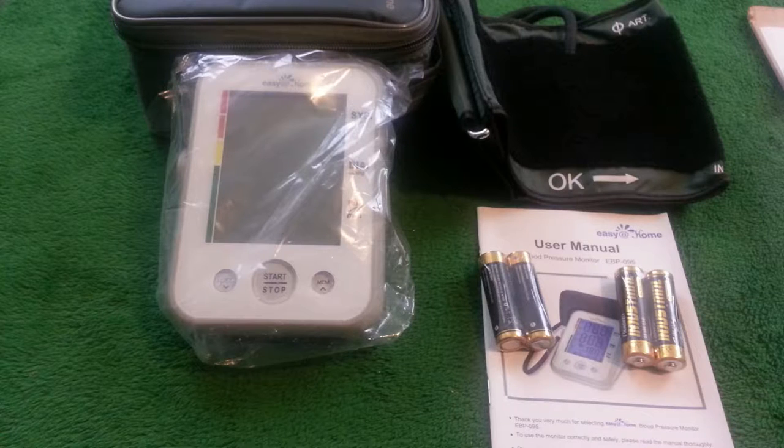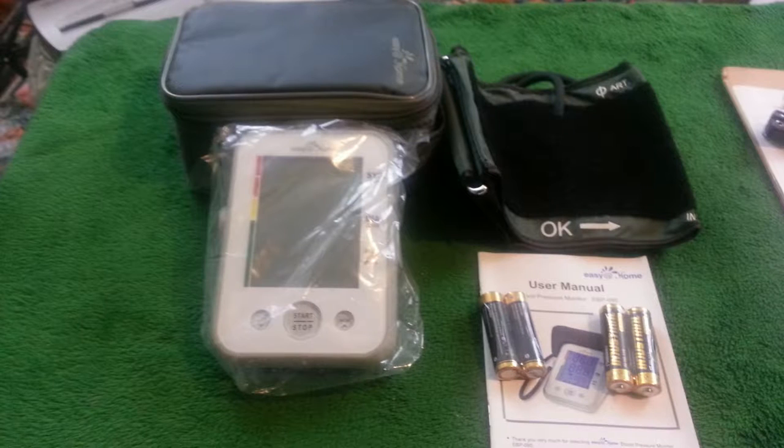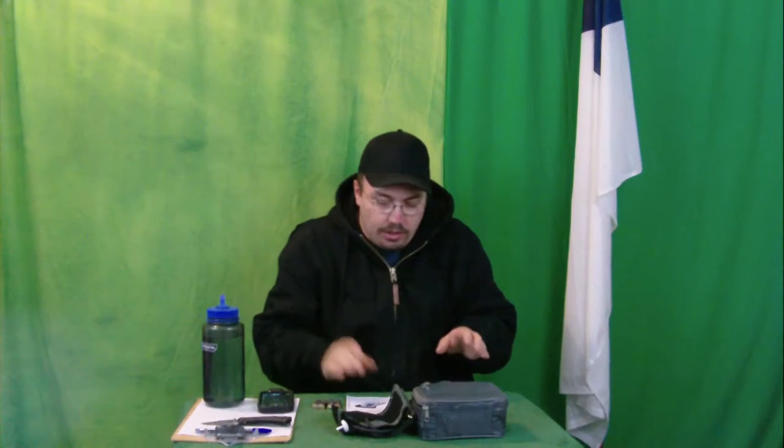We only have one unit that takes the batteries, I think. Thank goodness. So we don't need a whole bunch of batteries. We just need these four, I guess. And we got our user manual.